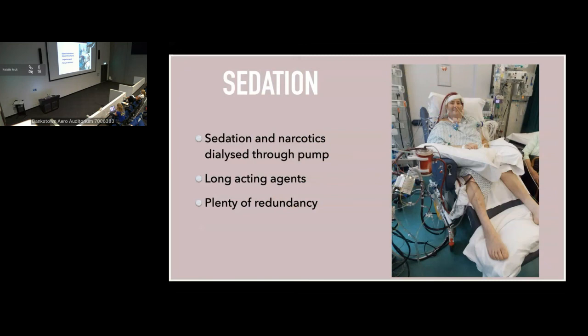In terms of your sweep gas flow, we normally set it at 2 litres and we progressively increase that over time. We don't want to reduce the PCO2 too quickly, particularly if you're starting with a PCO2 that's quite high. And that's just because the changes in CO2 will change the cerebral vascular tension, and the rapid changes in the vessel diameter can cause shear stress and micro tears. Now, if you add heparinization to that, you can actually precipitate an intracranial hemorrhage.